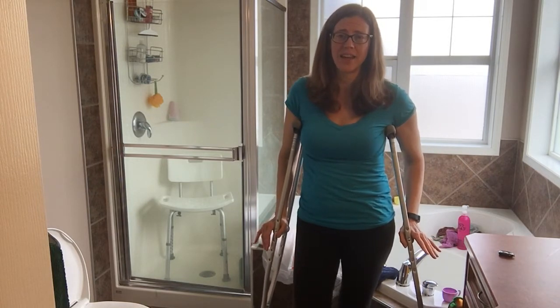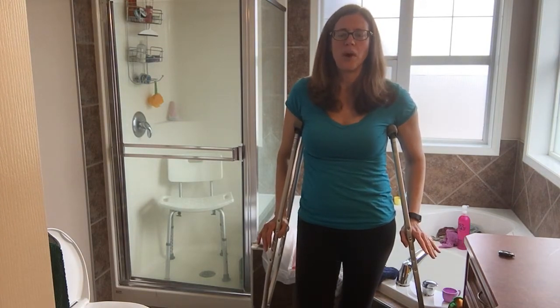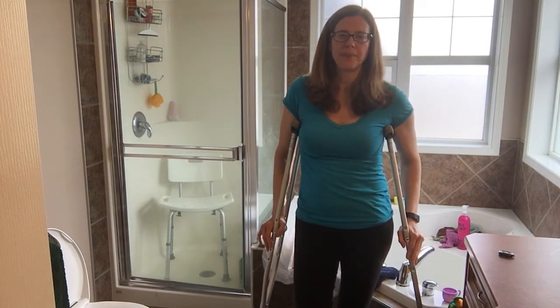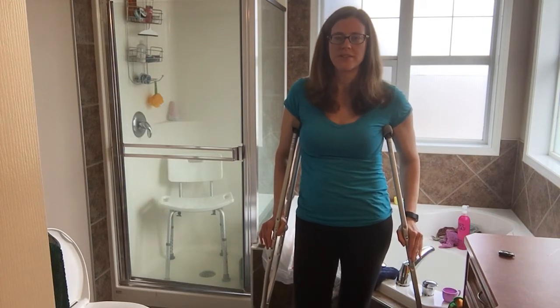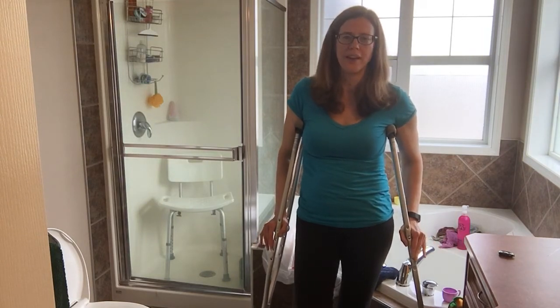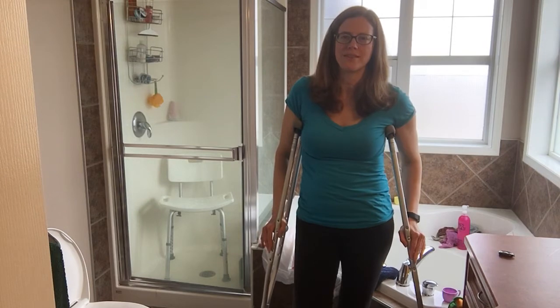Crutches are by far the easiest to get around in the bathroom because they just allow you to maneuver more than using a walker. Unless you need to use a walker, of course — but if you can use crutches, I find it easier. I can't use my scooter in here because it's just too small of a space and it's just not effective.